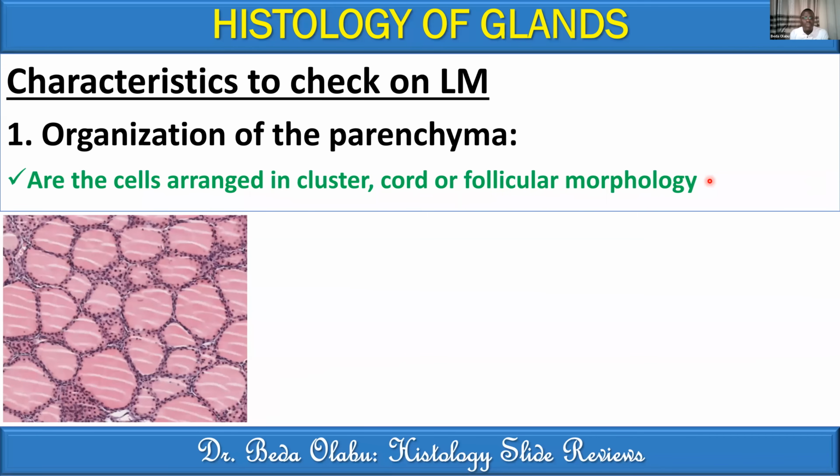Now, this image shows you a particular pattern of organization, the first image. So let's do this practically. I want you to write in the chat: is it follicular?